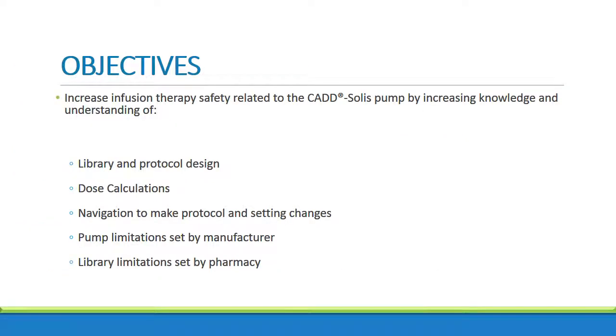In our experience, most of the mistakes that occur when using this pump are due to errors associated with drug concentration and changing the protocol. The purpose of this presentation is to increase infusion therapy safety when using the CADD Solis pump by increasing knowledge and understanding of the pump library and protocol design, dose calculations, navigation of menus when making changes to any settings or protocols, pump limitations that are set by the manufacturer, and library limitations that are set by the pharmacy.